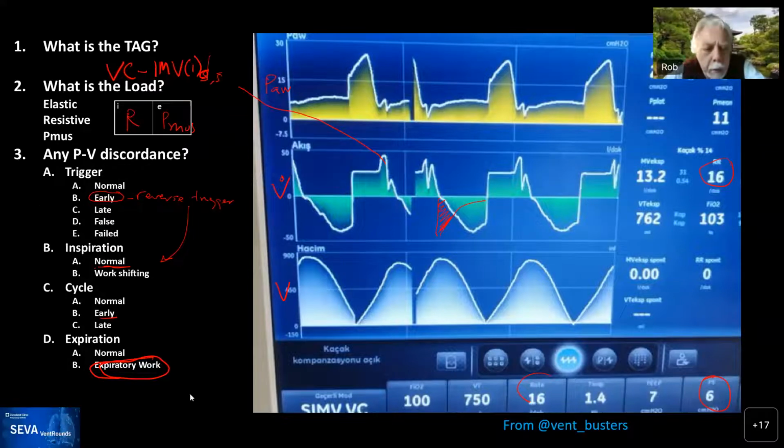Yeah, and just one quick note. Every time that we mention dual on VentRounds, it's usually from volume control to pressure control. And that's only because we don't have any ventilators that do it from pressure control to volume control, but there are some that do that. Right.